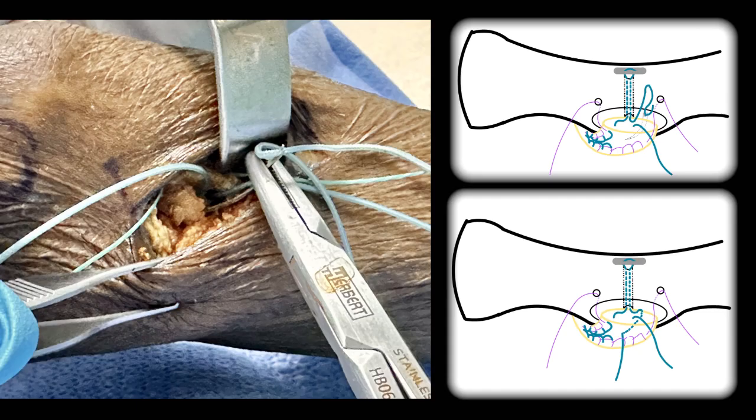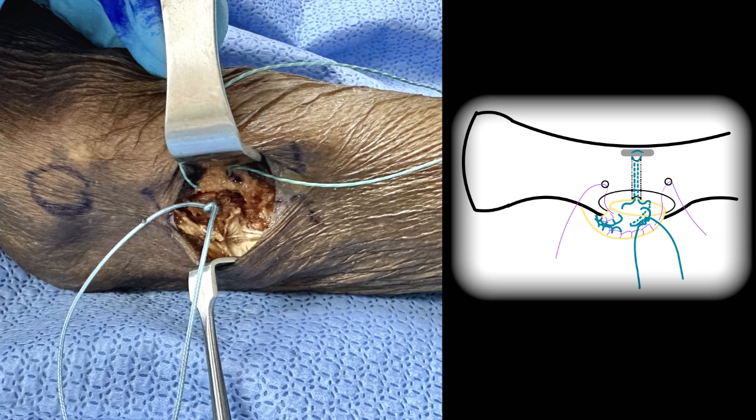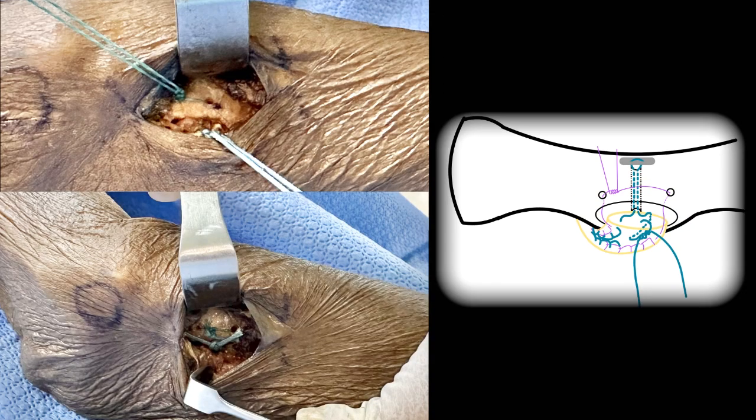Next, the stump of fiber wire number 5 that was previously passed from the bone tunnel at the center is then passed through the medial side of the tendon stump, which is the short head, using the needle. While tying the 2 stumps of fiber wire number 5, the assistant pulls the other 2 stumps of fiber wire number 2, and the elbow is in 30 degrees flexion. After that, both stumps of fiber wire number 2 are then tied.